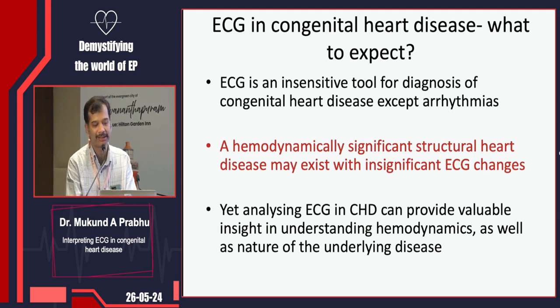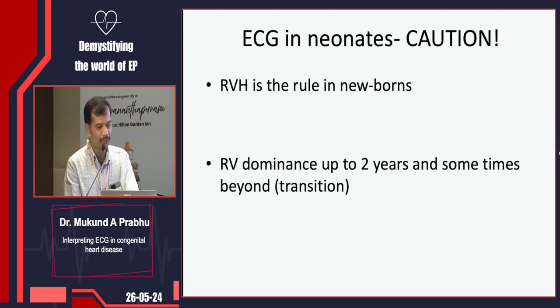We have to remember that ECG is an insensitive tool for diagnosis of congenital heart disease except arrhythmias. And a hemodynamically significant structural heart disease may exist without any significant ECG changes. Yet, analyzing the ECG can provide valuable insights in understanding hemodynamics as well as nature of the underlying disease. A word of caution, ECG in neonates as well as in pediatrics should be interpreted based on age.